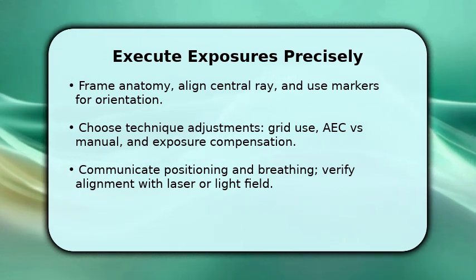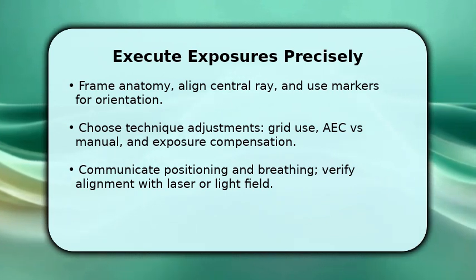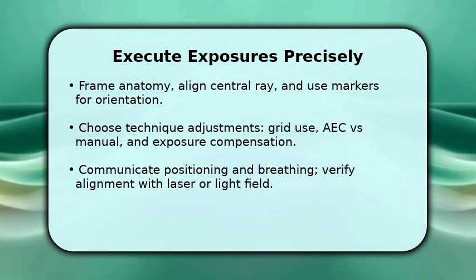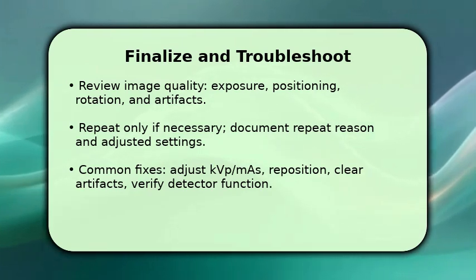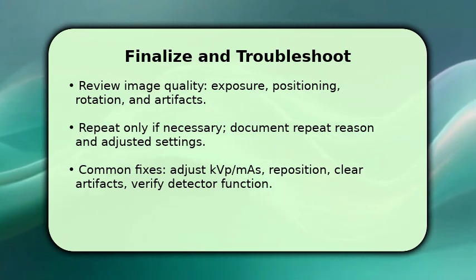Once ready, give a clear countdown, request any breath holds, and make the exposure while monitoring for motion and proper collimation to minimize repeats. After acquisition, immediately evaluate the image for exposure, positioning, rotation, and artifacts. If diagnostic quality is met, label and send to PACS.